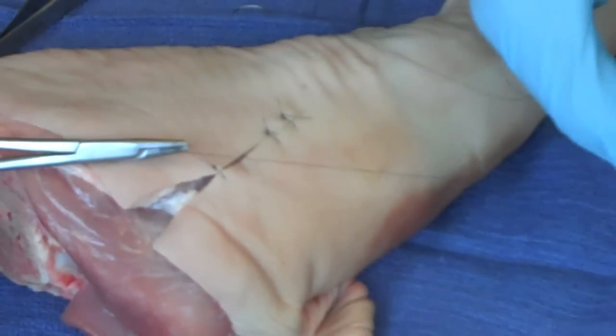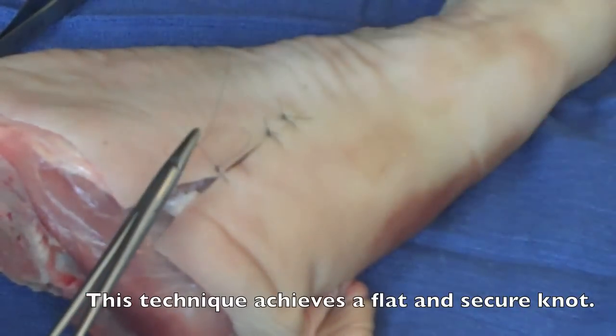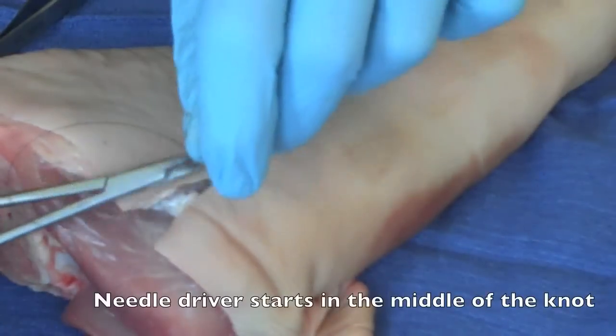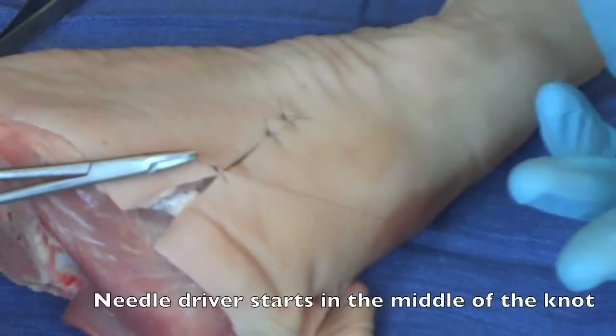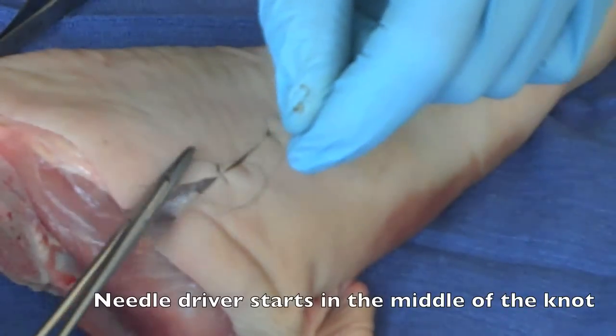The stitches will go down very nicely. I'm going from the inside of the wound, wrapping around, going out. Always from the needle driver, over the knot, wrap around, pull across. Single throw — inside, wrap around, throw across. That always gives me the right to left.